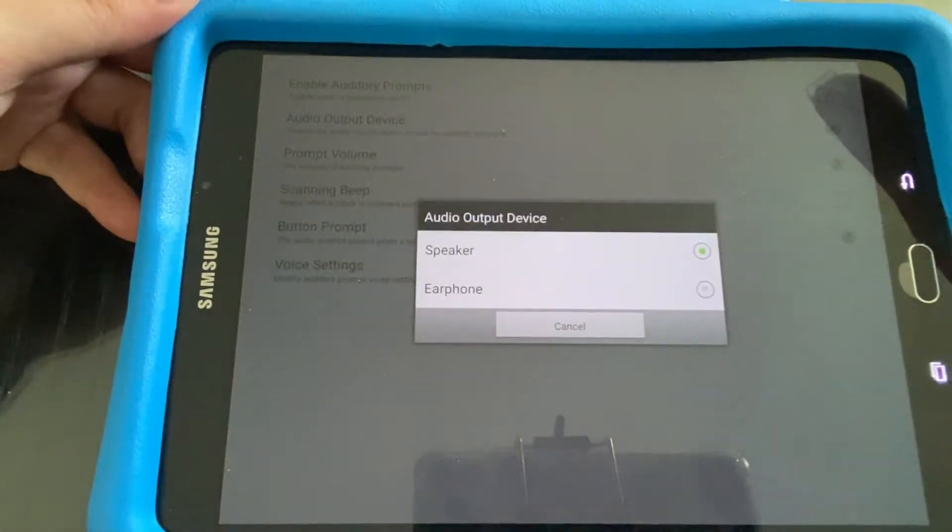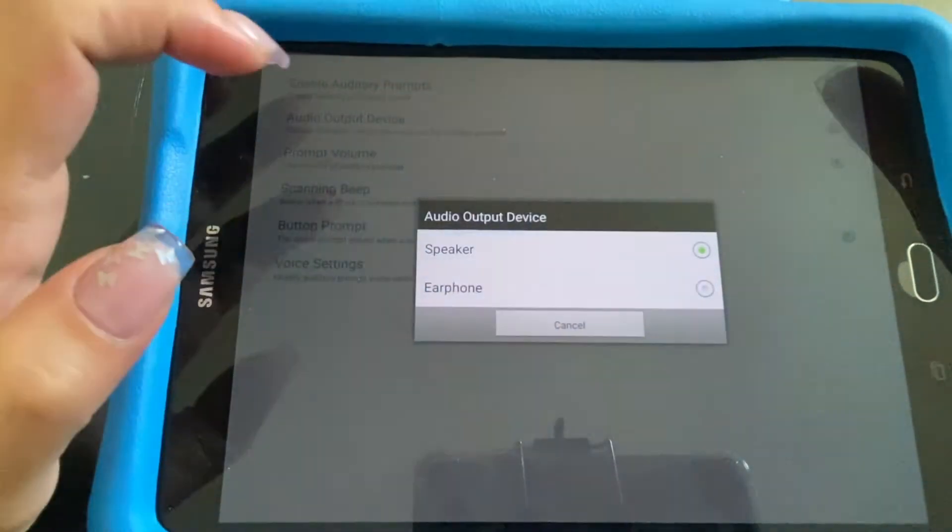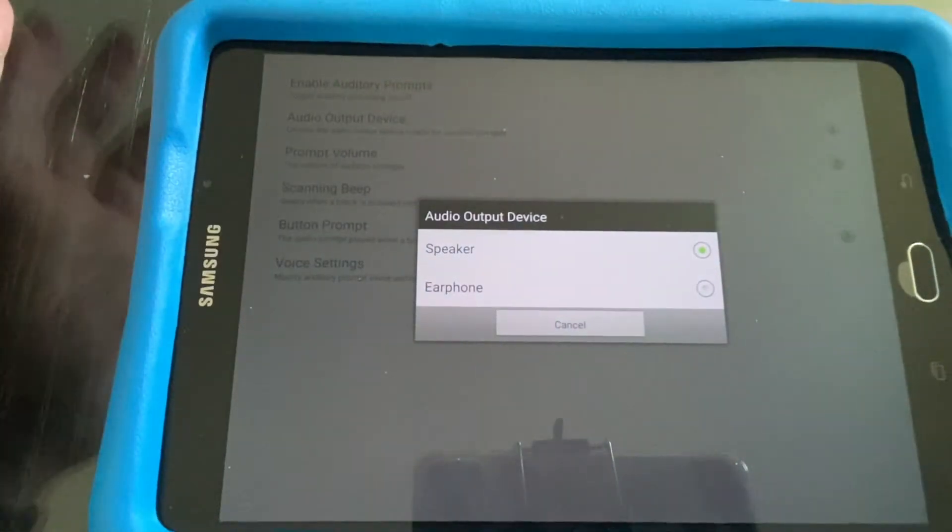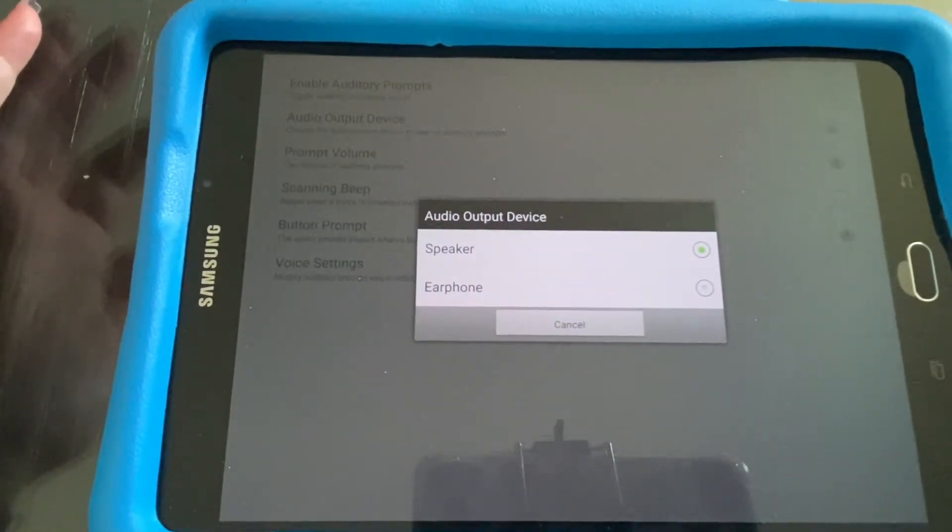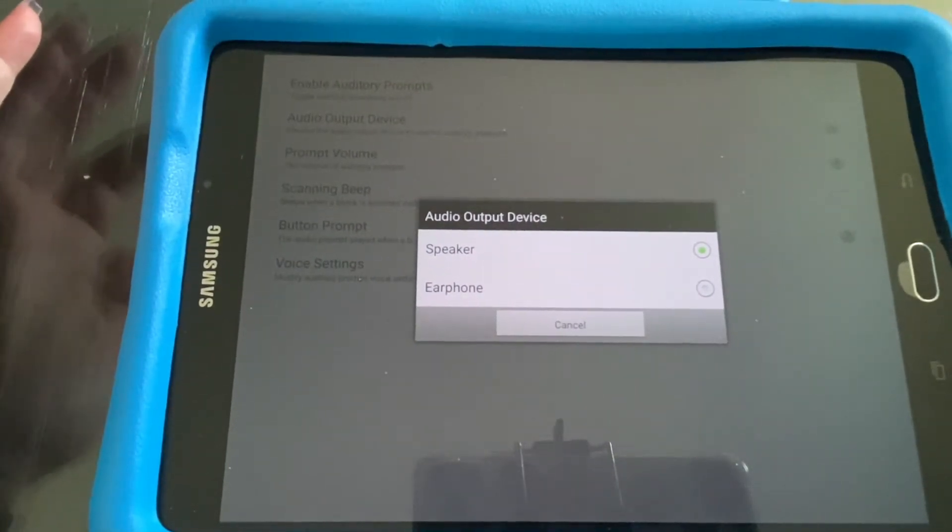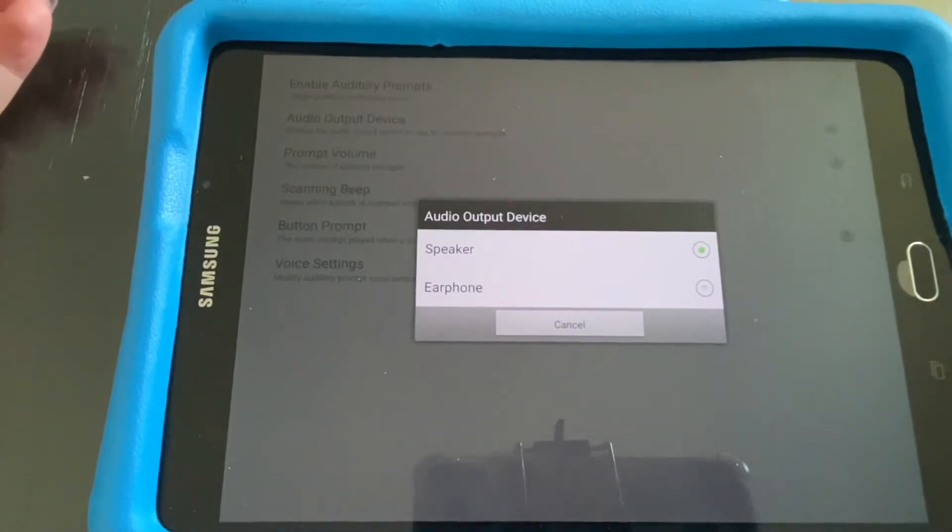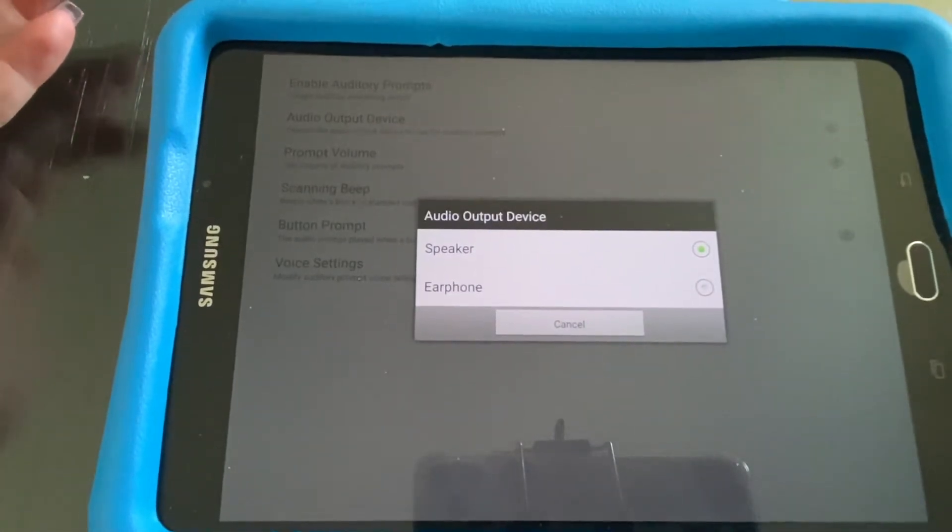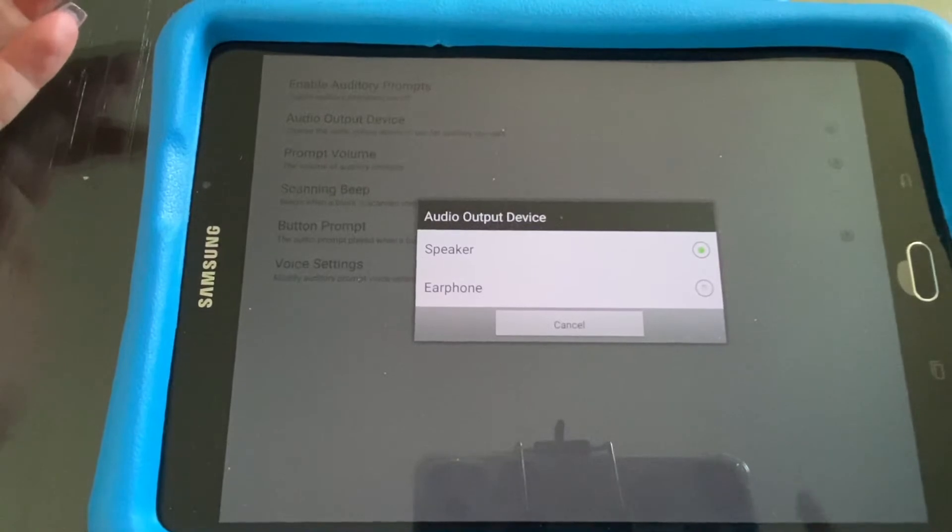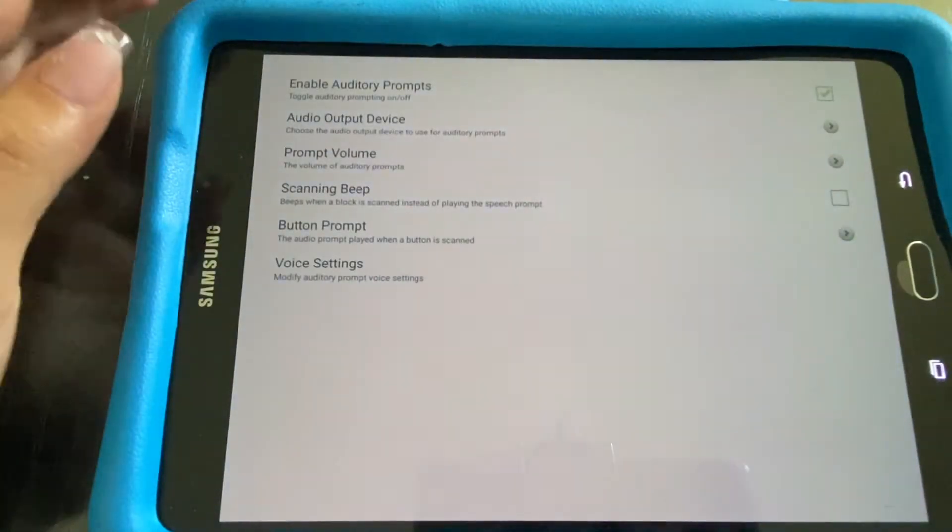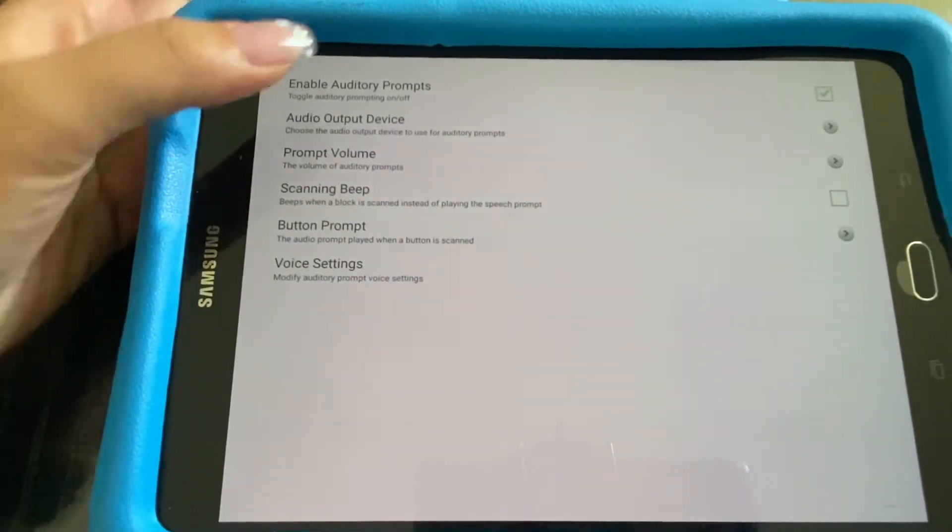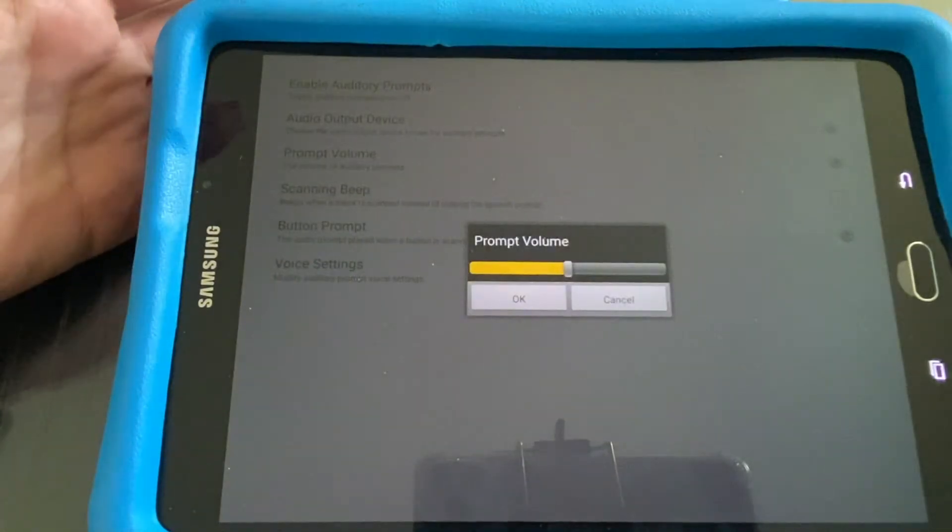You want to make sure it's on the speaker if you do not have headphones. Eventually it'll be great if the individual has headphones because they'll be able to hear the scanning in their ear, and then when they make the selection it will come out of the speaker from the actual device.